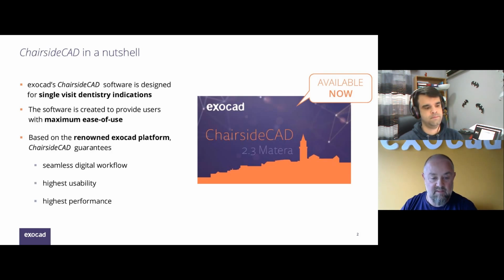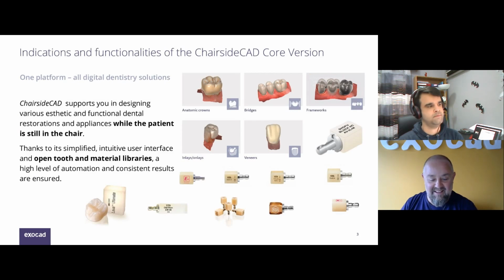With Matera's core version, we provide a solution for single visit indications like single crowns, bridges, veneers, and inlays. To offer an out-of-the-box product adapted to the market, our R&D and integration team is working constantly on integrating materials, libraries, and hardware.